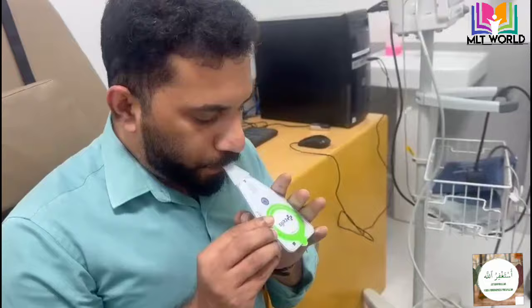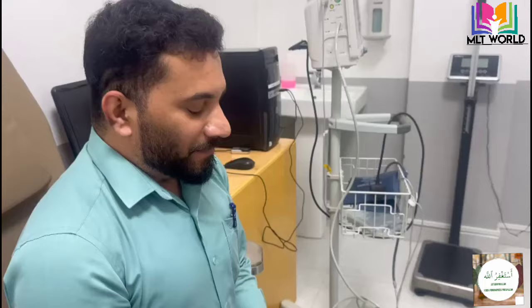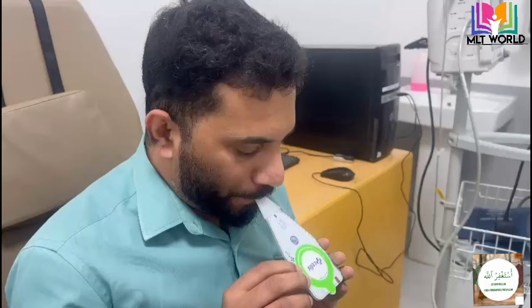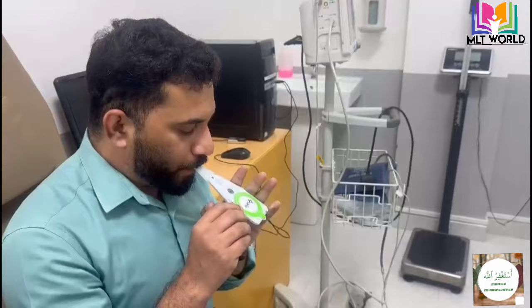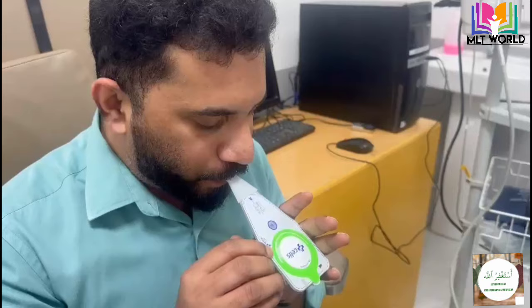I am making the video a little fast so there's no need to show 5 minutes continuously, but you have to instruct the patient like this: take a deep breath and then put it into the card. This process should continue for at least 3 to 5 minutes. In between, the patient can take a few seconds of rest — no need to continuously tell them to inhale and exhale without pause.